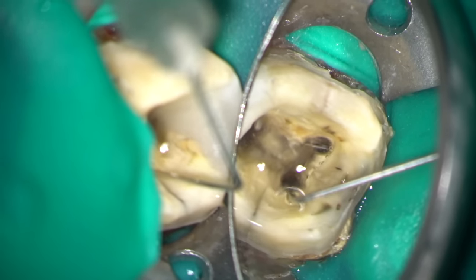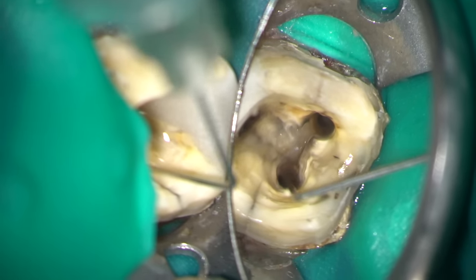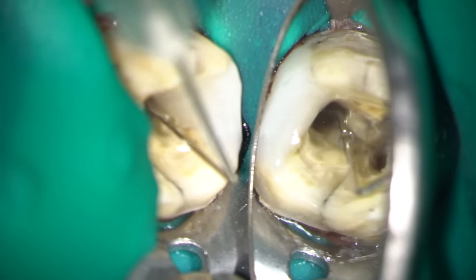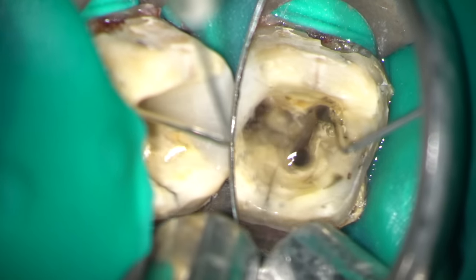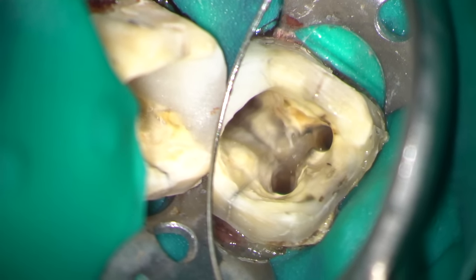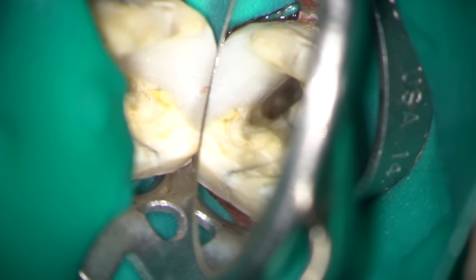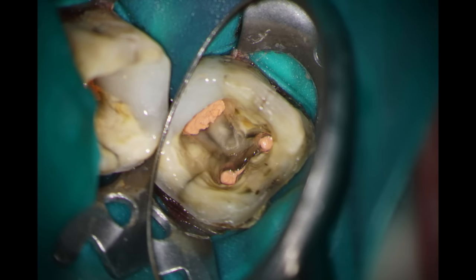Once preparation was complete, it was time to carry out the irrigation phase of treatment, and in this case you can see beautiful convergence between the mesial canals. The tooth was obturated using a vertically compacted gutta percha technique and the access cavity sealed with a dual cure composite.